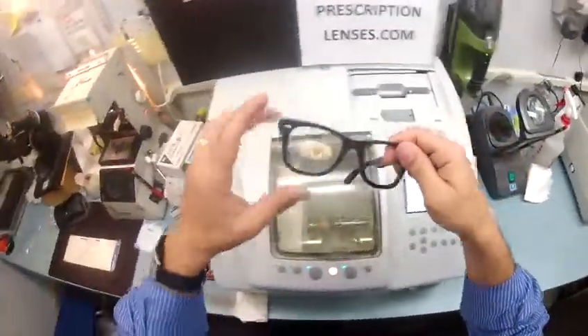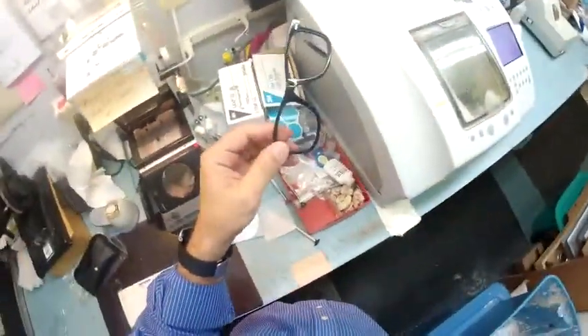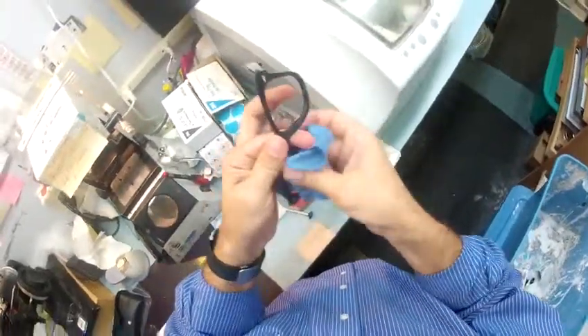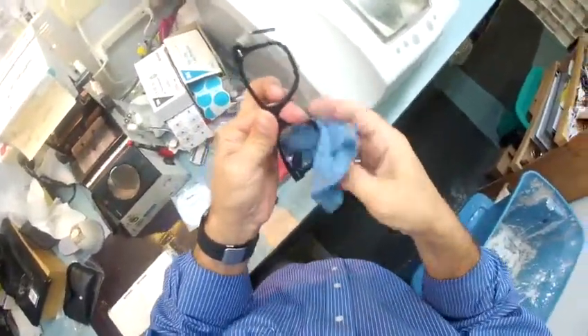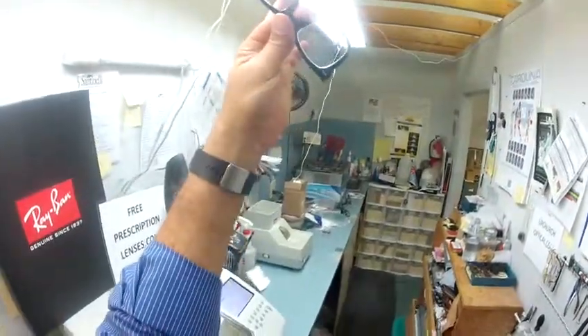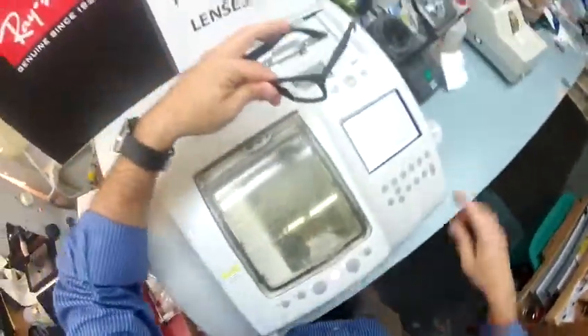Your left lens is cutting. I'm going to go ahead and take the block off of the right lens, pull the little suction off. I'm going to dry your lens off and hold it up to the light to make sure there are no blemishes. And we are good to go.